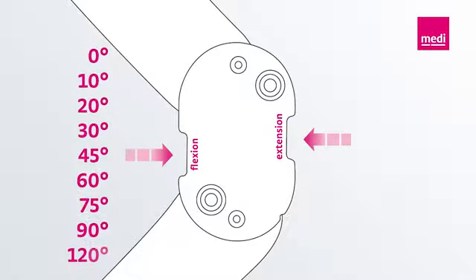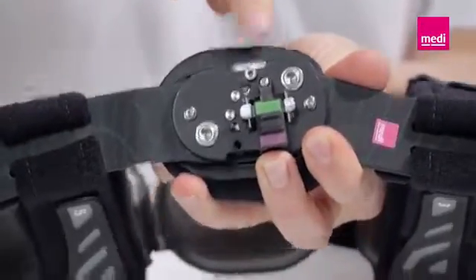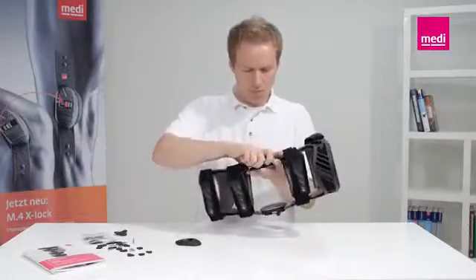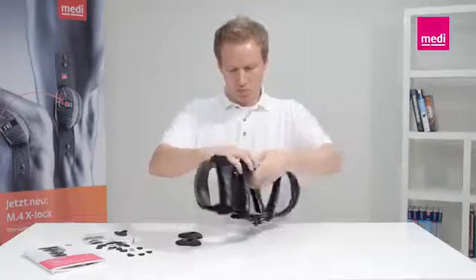0-degree extension wedges are pre-installed in the M4 locks. The wedges define the radius of movement of the knee. To set the limits of extension and flexion, please first remove the side covers. Please note that the locking mechanism is only activated when the 0-degree extension wedge is fitted. The orthosis is delivered by the factory with this wedge mounted.